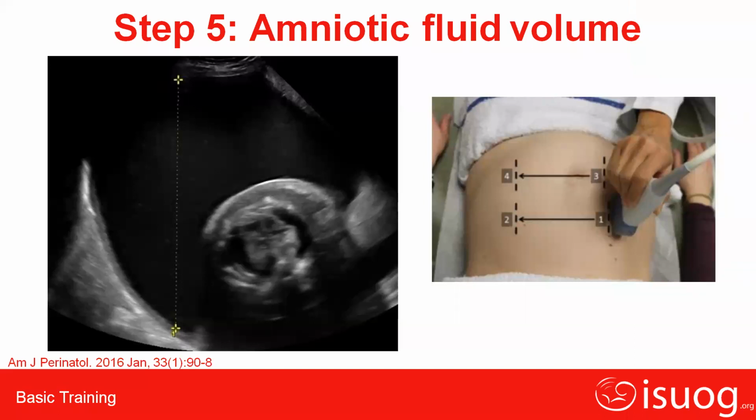So in a TIFA scan, it should be absolutely clear in the early weeks. Truly speaking, yes, maybe meconium stain or blood, but we have realized that as technology has advanced, we are picking up more and more smaller particles within the amniotic fluid because of high resolution transducers. So a diffuse increase in echogenicity within the amniotic fluid would not worry me anymore.